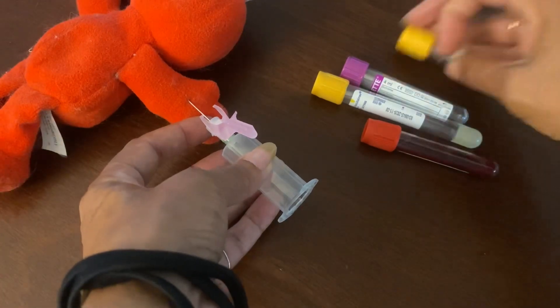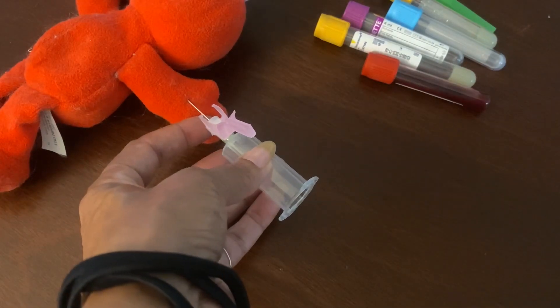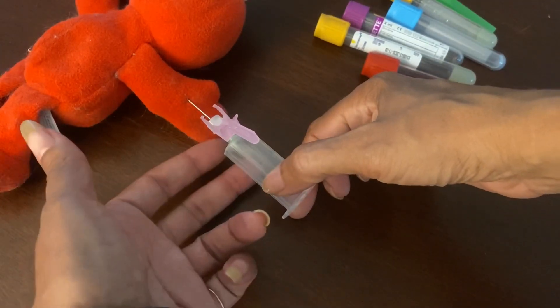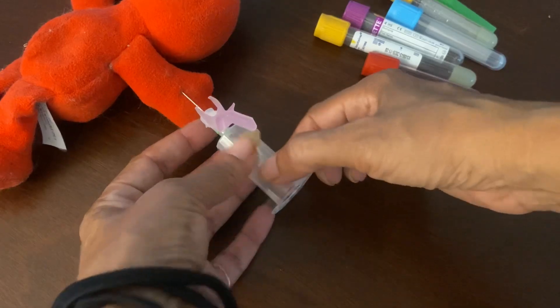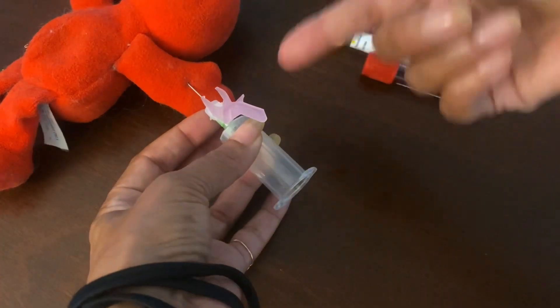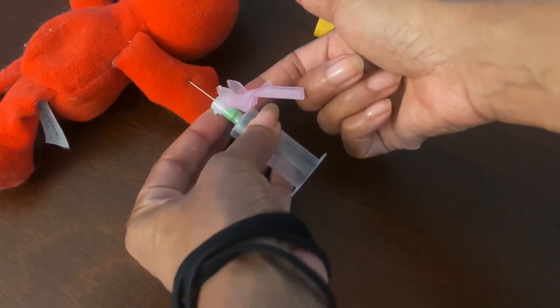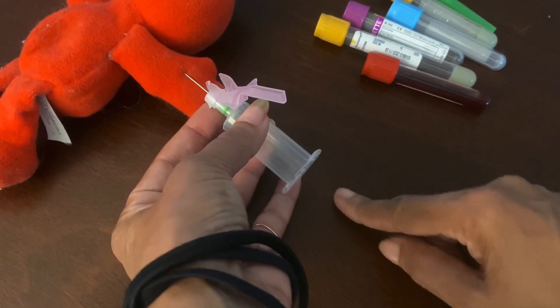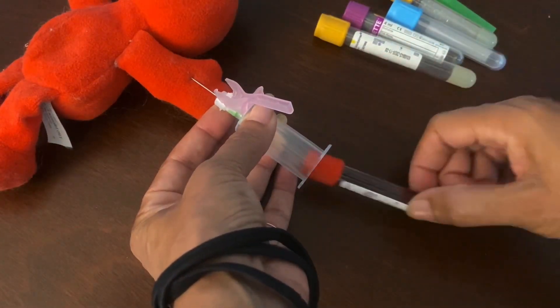I can use the feet of the holders better, I can remove the tubes better — just so many things can go right by switching and having control versus not switching and not having control. I know I babbled through this video because Kenny started barking, but this is me switching hands. I stuck with my right, I switched. Use whichever fingers, however it feels good to you. My pinky always ends up on the backside of my patient's arm, and there's not going to be any movement of my needle because my index finger is holding the hub. I'm not contaminating the needle — I'm holding that. I have control because of my finger on the arm and my thumb is holding the holder. This right here is control.